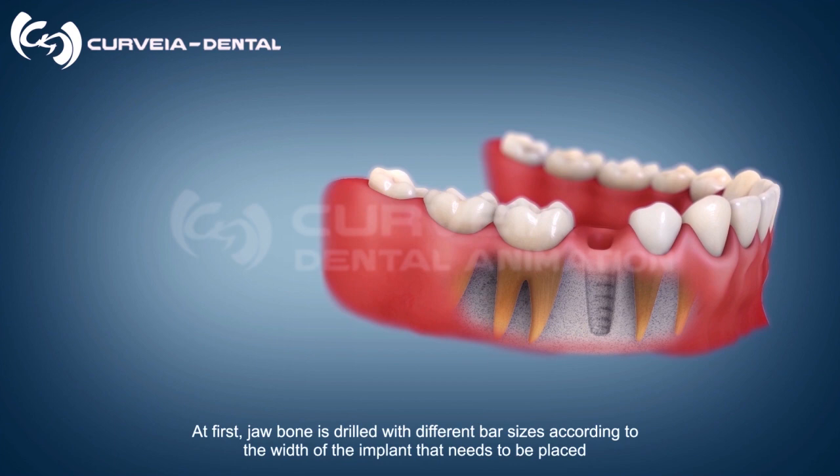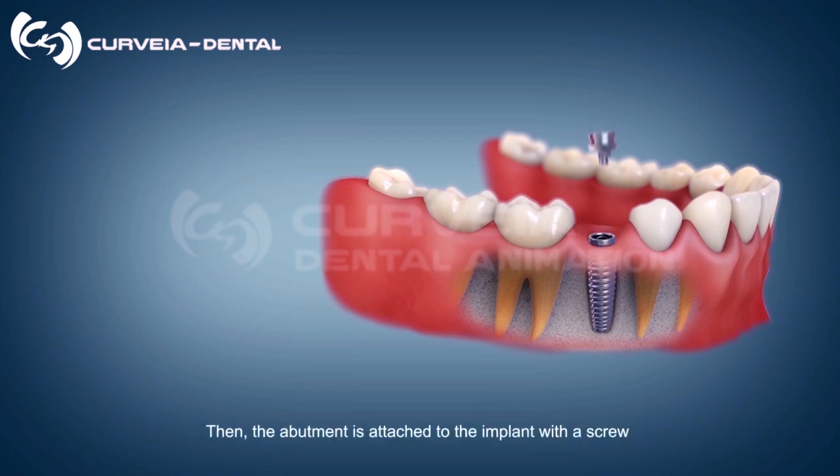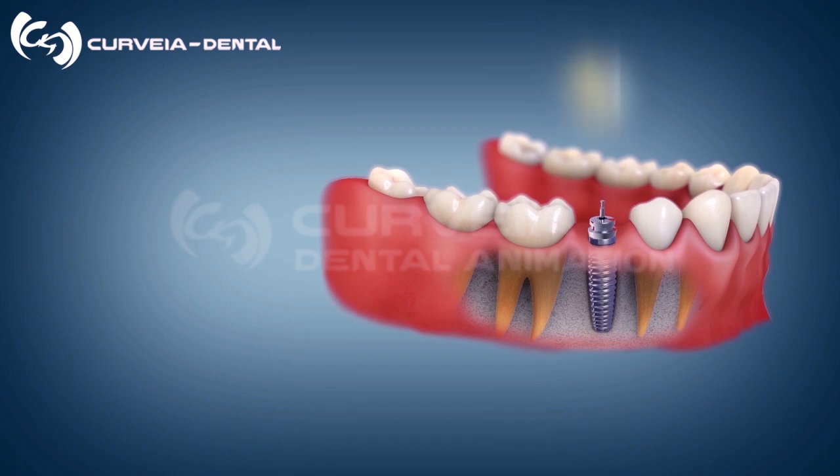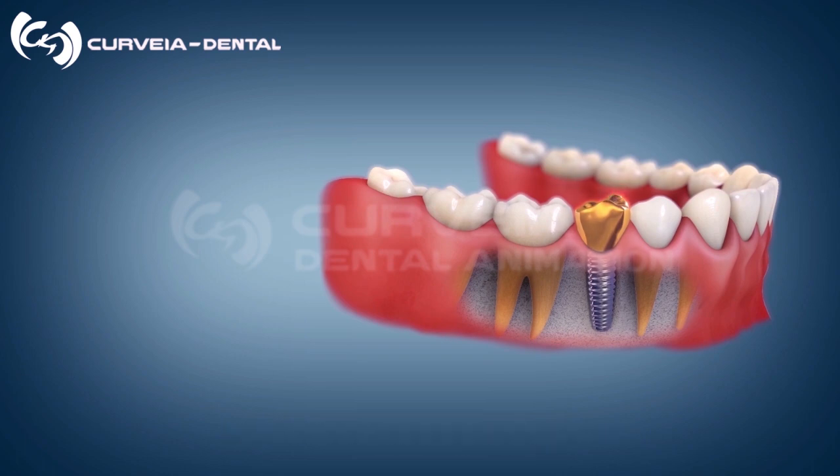In the next step, a titanium implant is placed in the lower jawbone. Then the abutment is attached to the implant with a screw. After that, a gold crown is positioned onto the abutment.